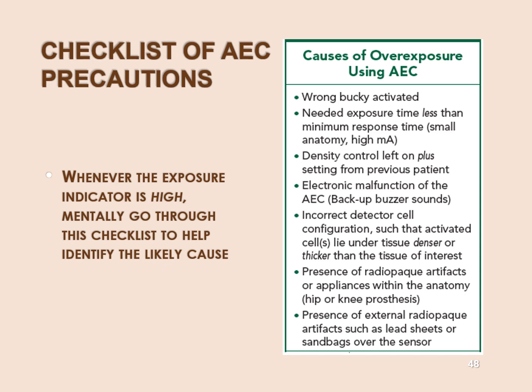All right, so how can you screw up with AEC? Activate the table bucky when you're positioning at the wall, at the upright bucky. Only the older equipment can do that. Everything else is going to give you the fail-safe lockout. The new stuff is going to say, no, you're doing it wrong. Need to fix it before I'm going to expose.